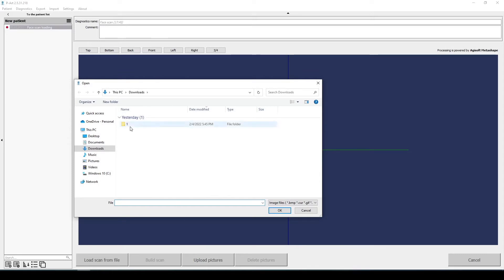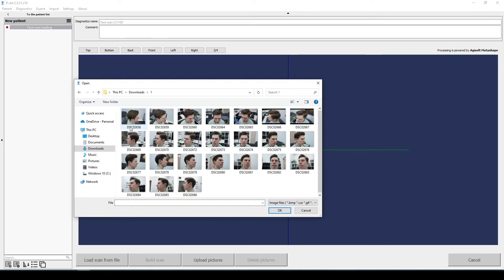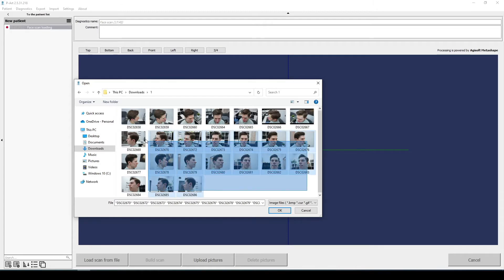All photos are taken with photo marker and specific camera settings. Select photos and upload them in the program.